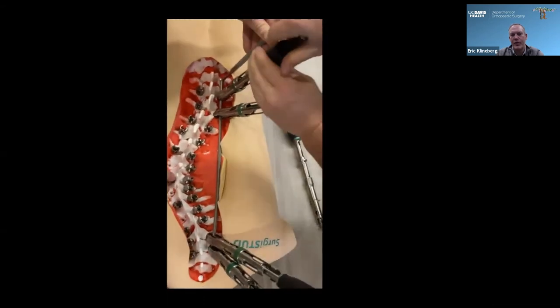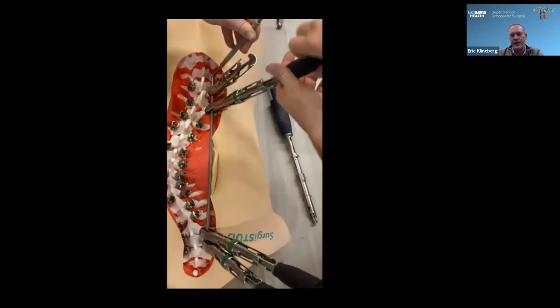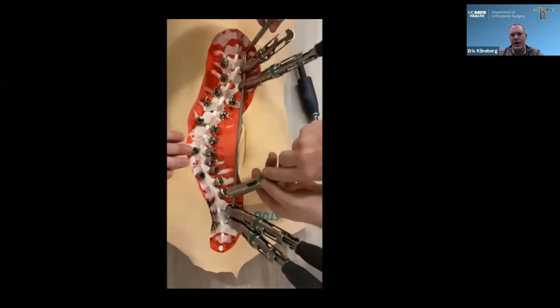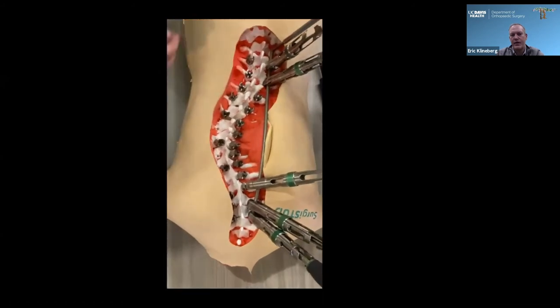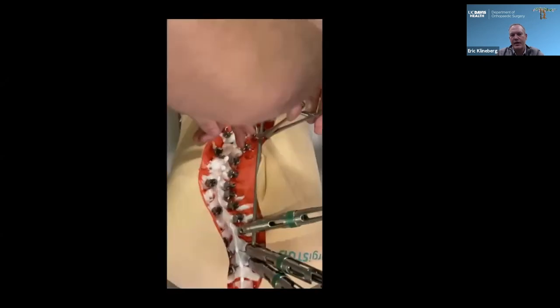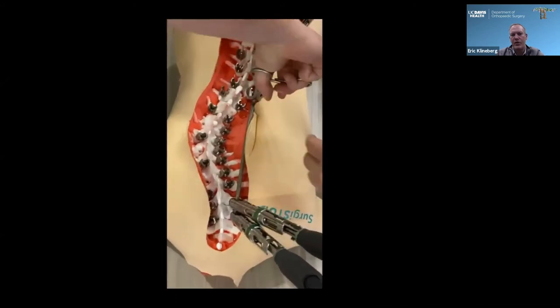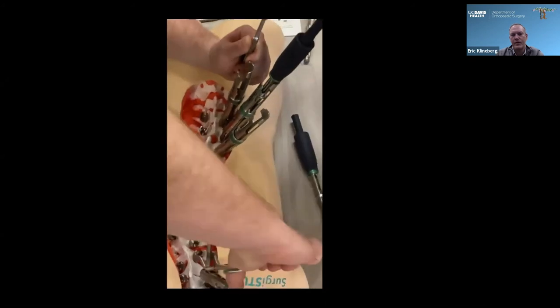And usually the poor resident or medical student, whoever's holding that hex, doesn't realize how much force and how much work they're doing to help hold things in place and allow things to translate in the right location. And here there's another trick. Sometimes we can't get the tulip over to the rod, and so we'll use a hook holder to grab that rod and bring things over and get those in place.